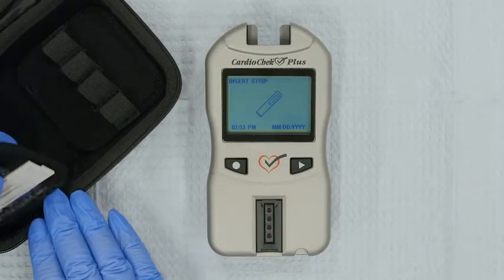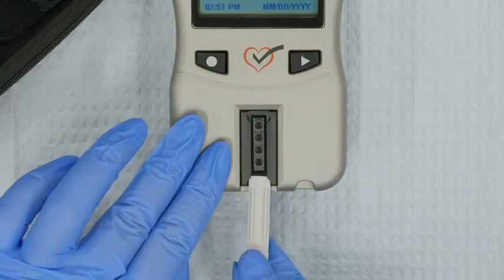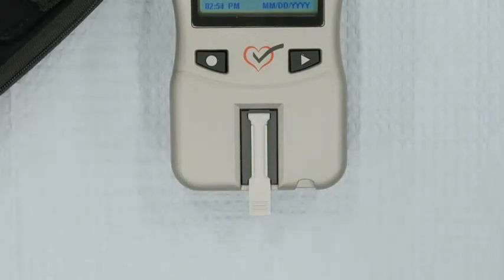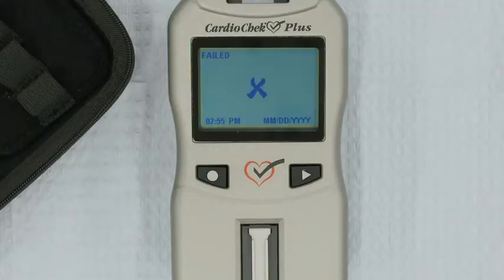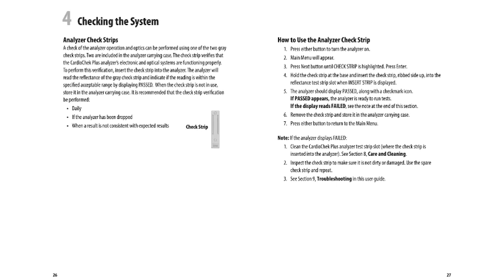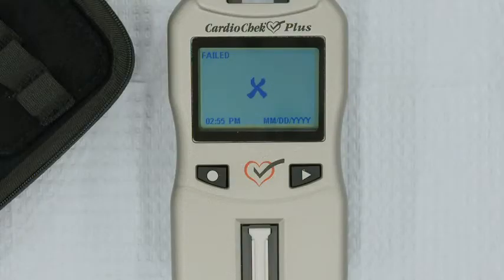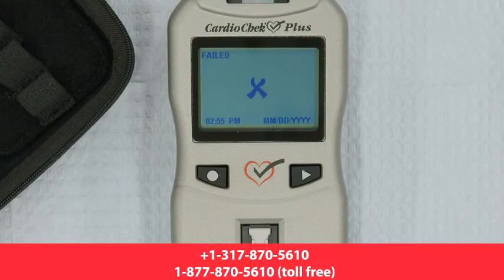When Insert Strip appears on the screen, insert the gray check strip, ribbed side up, into the reflectance test strip slot. Do not move the analyzer during testing. If the analyzer screen says passed, good news — you're ready to run controls. If the analyzer says failed, you'll want to make a few adjustments and try again. Please refer to Section 4 of your CardioCheck Plus Version 1.12 User Guide for details. If your check strip verification still fails after all troubleshooting measures have been taken, please do not use the analyzer. Call customer service for assistance.